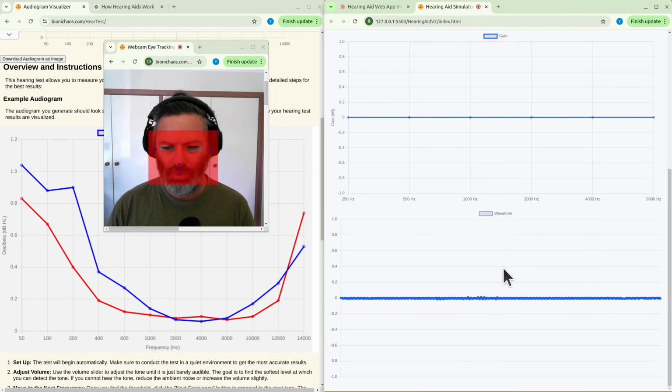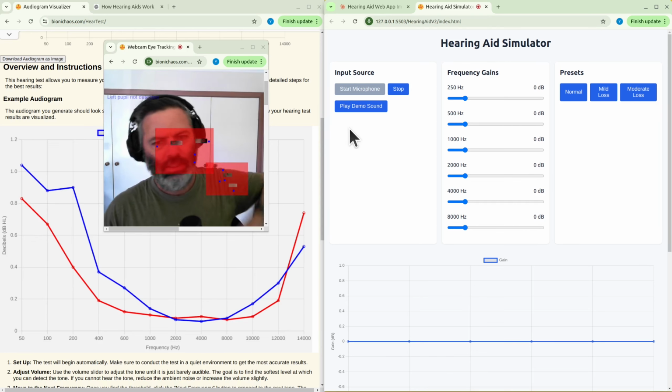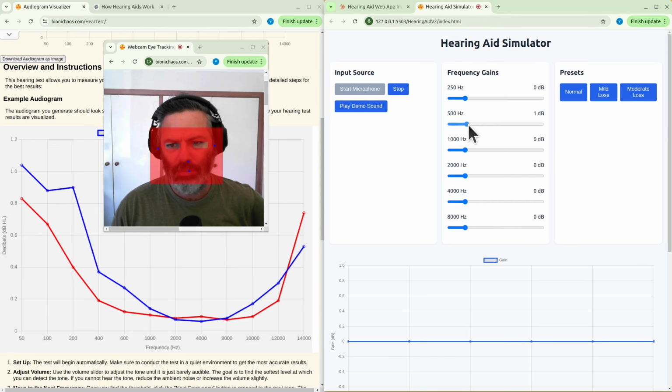Yeah, there's currently some sort of weird, it's called attack timing. So there's some sort of delay in the processing. Yeah, now it's amplifying. Yeah, it's really annoying. It actually takes some time to work.